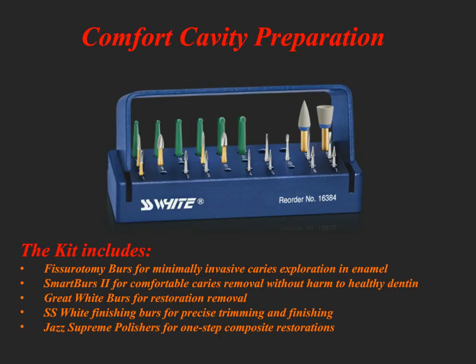This is a picture of the comfort cavity preparation kit from SS White. This kit includes all of the burs that you will need for minimally invasive caries exploration, for dentin excavation, for restoration removal, for trimming and finishing of composites, and for polishing of composites.